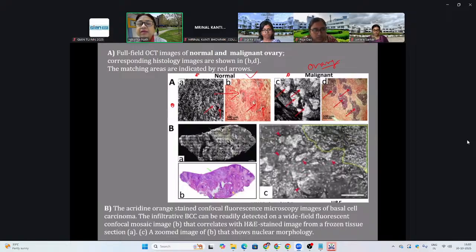But in a tumor, you will have the macrophages. In all these slides that I showed even in the last couple of days, you don't see a lot of cystic fluid. So you see mostly macrophages, stromal cells, fibroblasts, the cells that I talked about yesterday and the other day in the tumor microenvironment. For the most part, they will be very tight, so you will not see collagen floating around everywhere.